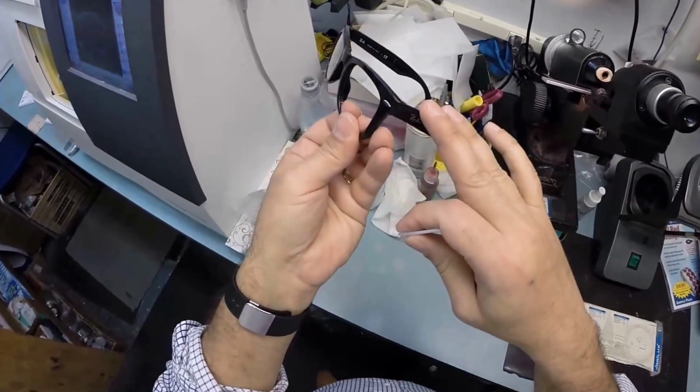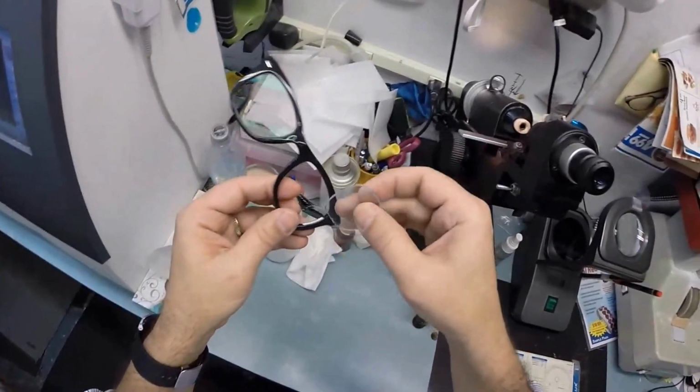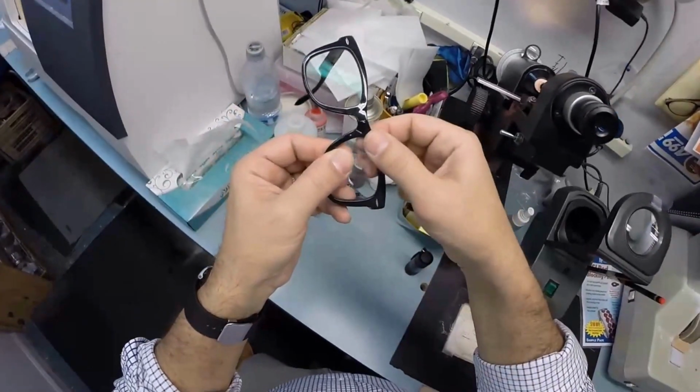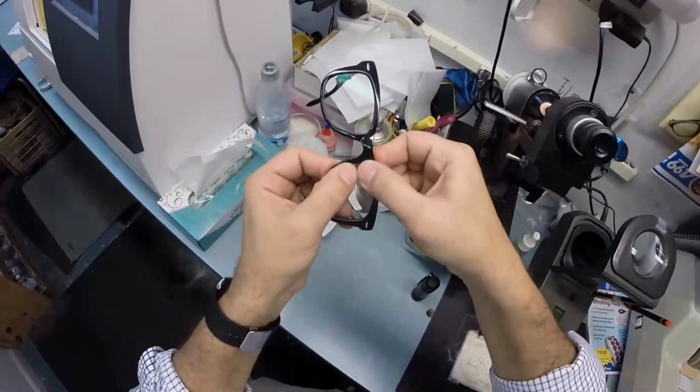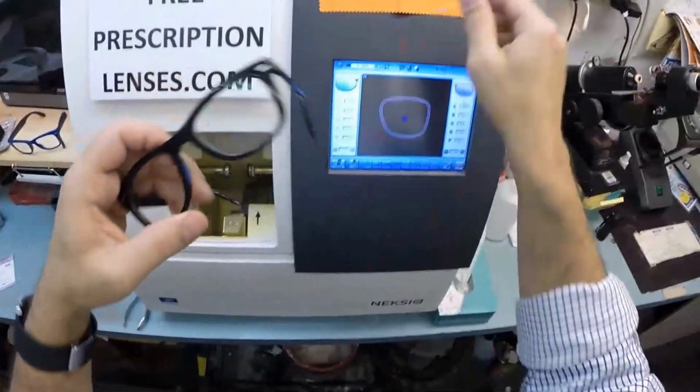If you leave your frame in your car on a freezing night, this plastic can become brittle, so just wait till the frame is at room temperature before you work on any plastic. And I did that so quick, but again, tuck it in the outside corner, press down with your thumbs. Now, this is what your lenses look like now.